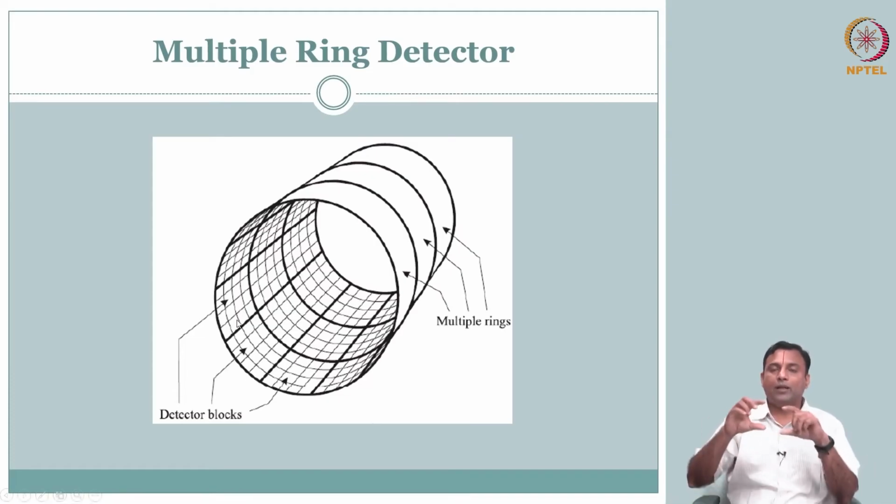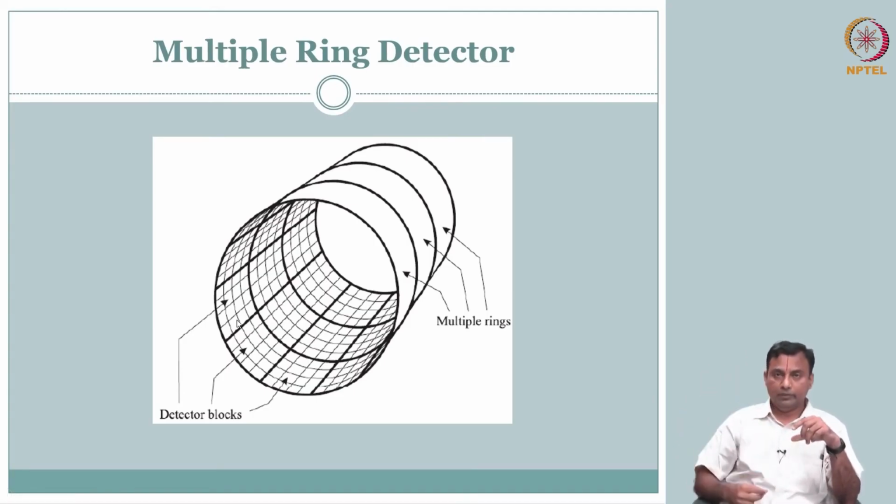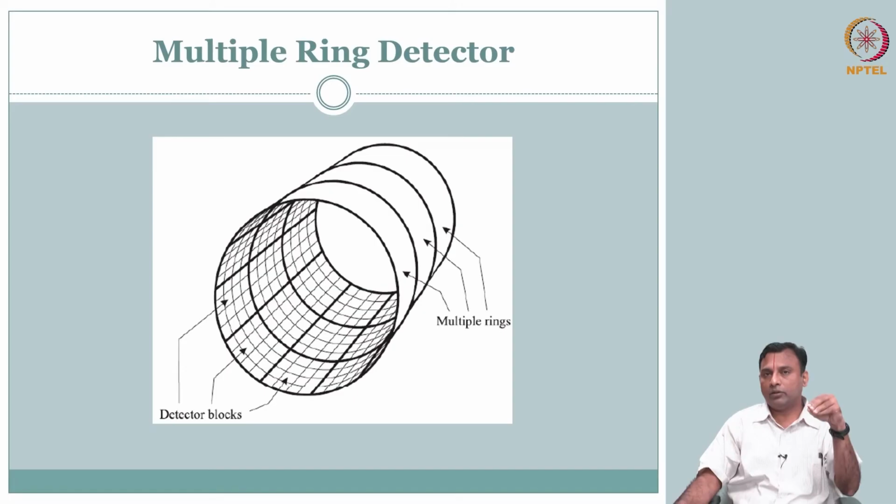So this one block is one crystal, and in the example shown that one crystal has 4 photomultiplier tubes, and therefore what is nice is, you are still able to localize within that crystal. So you can get your good signal to noise ratio and better resolution, because you are able to correct for your x comma y, and you have several blocks. So this arrangement provides multiple benefits for the reason that we talked about.